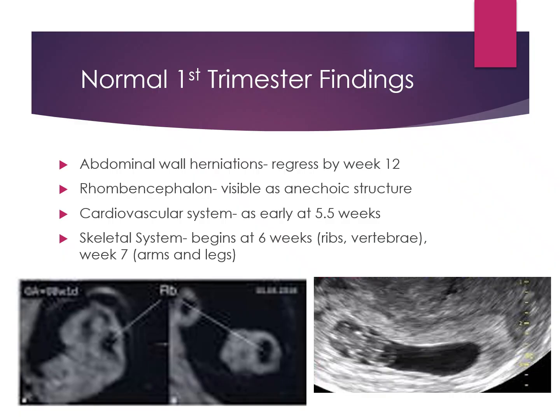All right, so some things that we can expect to see when we are scanning, 6 weeks, 7 weeks, 8 weeks, whatever it may be.